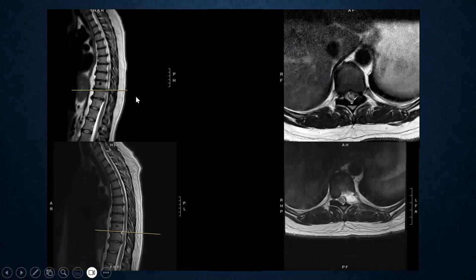And this is, again, did the same thing. I marked the patient, got an MRI post-marking to make sure I'm doing surgery at the correct level. And then this is a post-op scan showing a beautiful decompression of the cord. And you see how smashed the cord was because you see the T2 change in the cord after the decompression. And again, 6-millimeter incision, went home the next day.